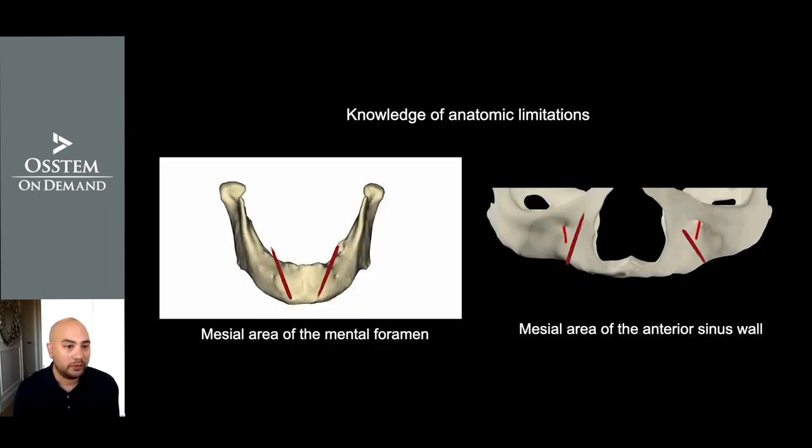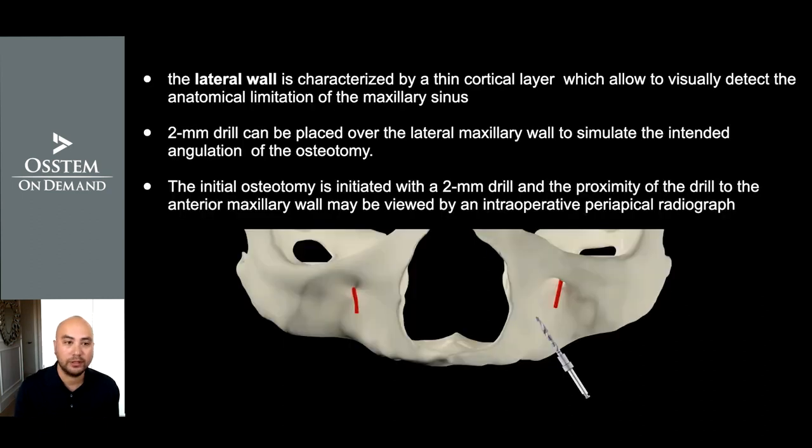It is important when placing the implant in an angled position to familiarize yourself with the neighboring anatomic structures. There are also certain techniques that we need to be conscious of, and we use the initial drill to guide us to avoid the lateral wall or the mental foramen.